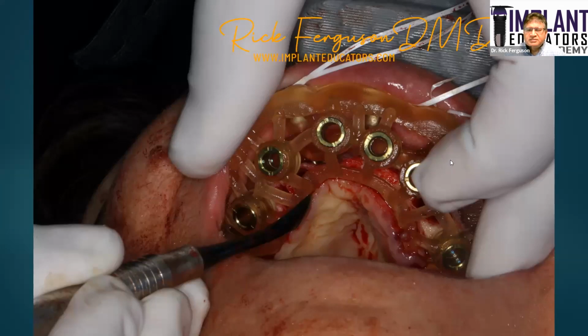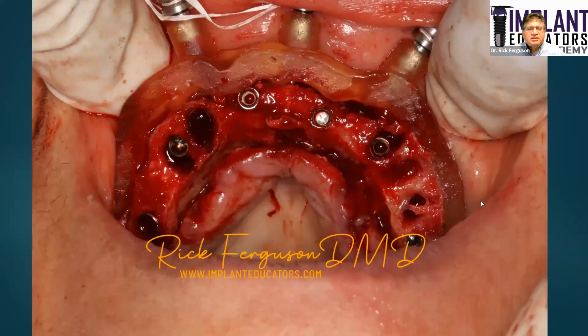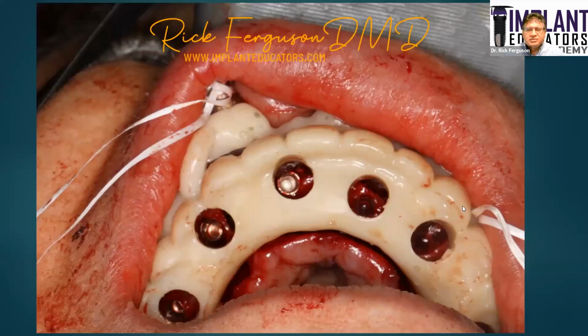Now this is an open style drilling guide that I designed. And what we're doing here is actually pushing the tissue out of the way to make sure that this seats properly, so the seats on the bone reduction guide fully, and then the sites were drilled. These are the implants now in place. They were also placed through that guide for the maximum precision.